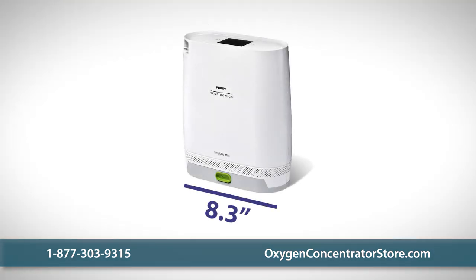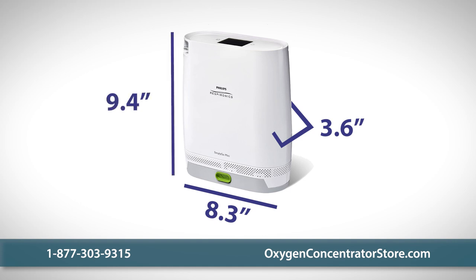The Mini measures 8.3 inches wide, 3.6 inches deep, and 9.4 inches high with a standard battery. The extended battery is nearly the same size, giving you freedom to choose the power and weight option that works best for your lifestyle.